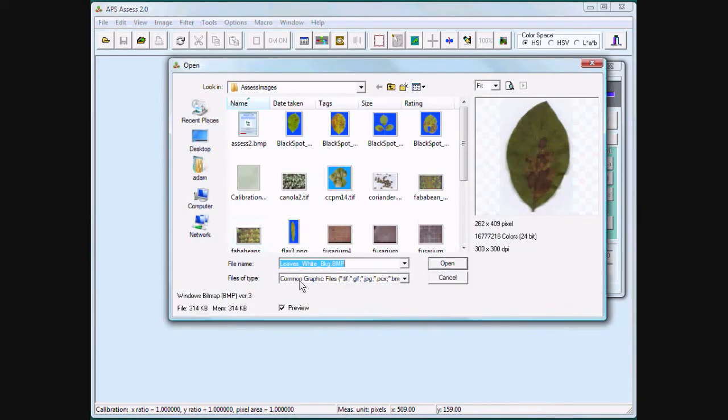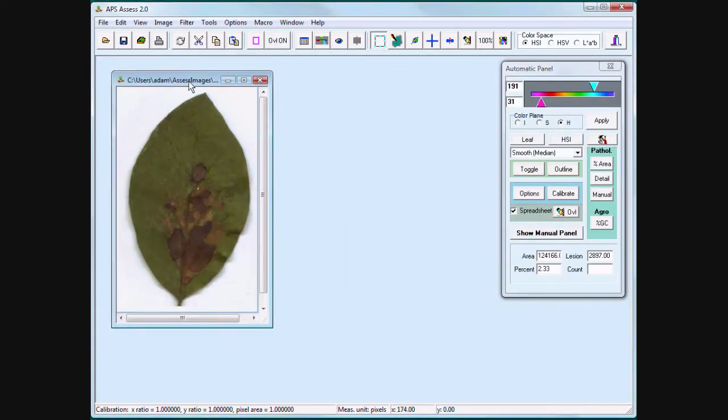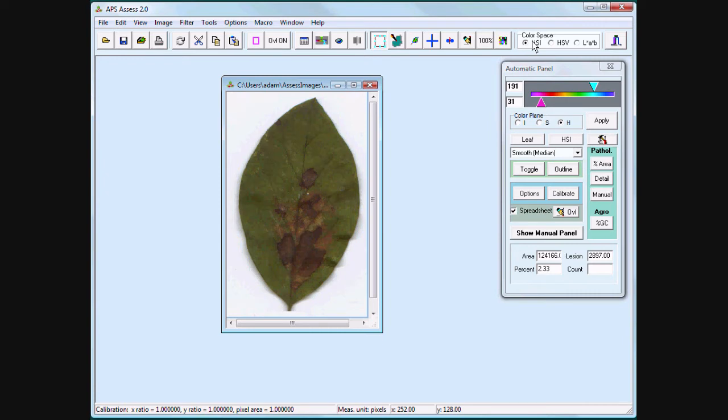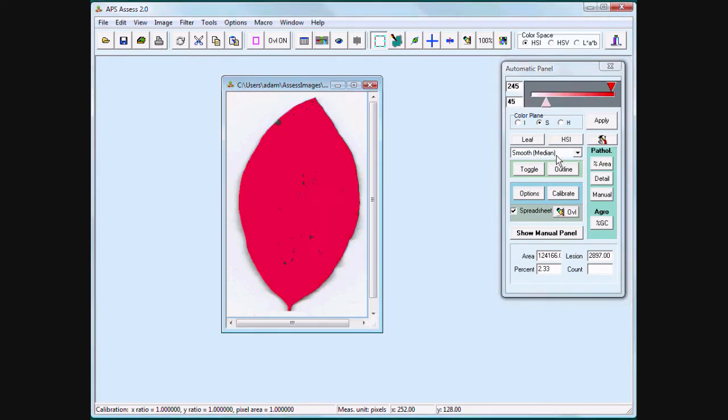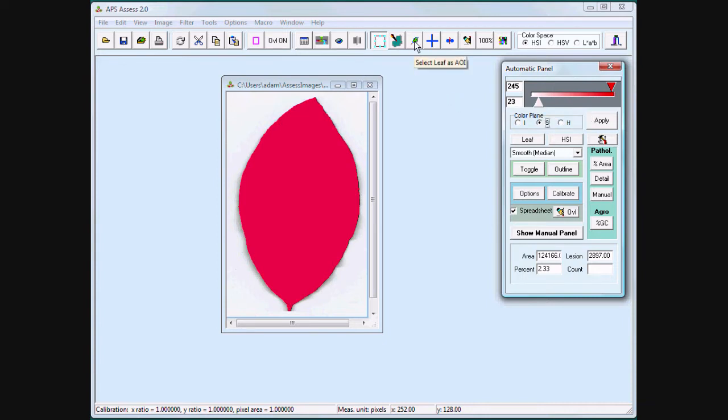Even if my leaf is on a white background, I can still use the manual panel to threshold the leaf. I have an HSI color space. I am going to use saturation to threshold the leaf. I use saturation because the background is white, it is colorless. And also select Leaf as Area of Interest.